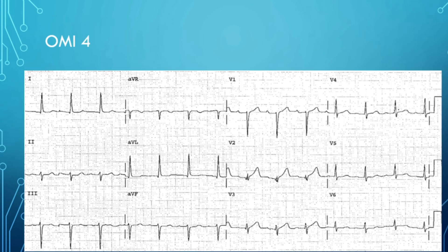Now we should be getting the hang of it. Look around and see if you notice anything. You can see some minor depression in the inferior leads, and there are hyper-acute T waves in the precordial leads V2 and V3 — very small QRS with a T wave that juts off and is much larger than the QRS. V3 is also becoming a little hyper-acute.